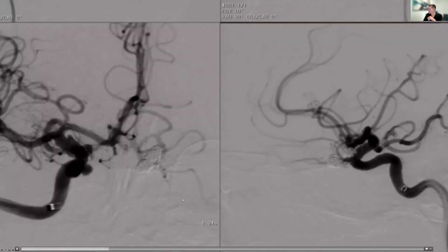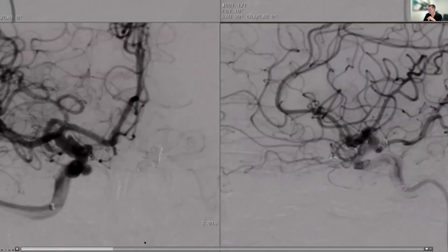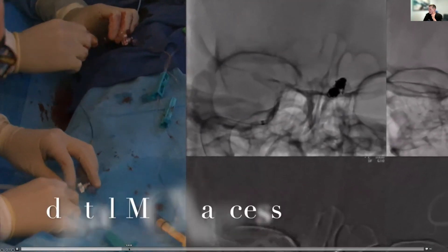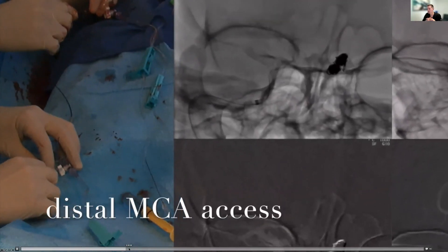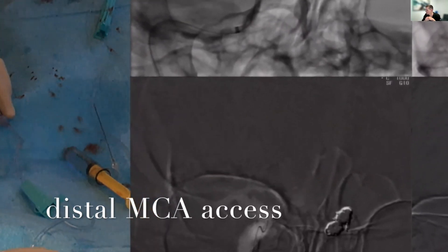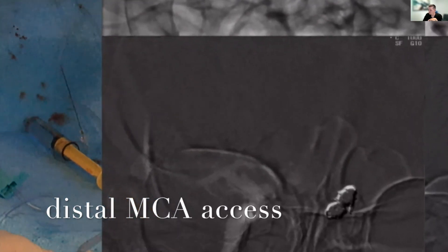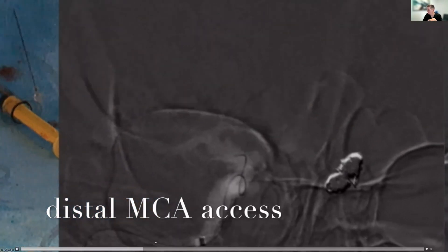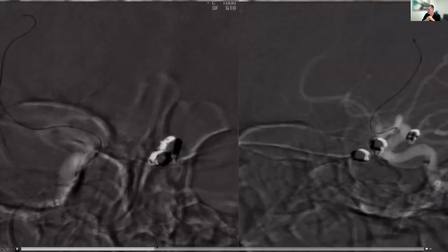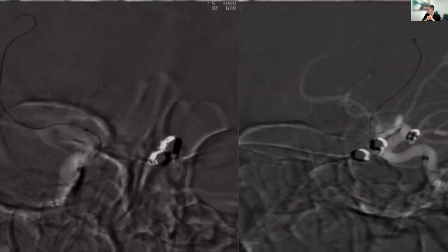This is a pretty simple procedure for most people, and the better the devices get, the easier this becomes. The nice thing about this is you don't have to actually access the aneurysm, so the hemorrhage risk with this kind of procedure is significantly lower. The real complications come in getting the stent to open — having newer devices really helps because the easier it opens, the quicker the case and the less likely you are to have thrombotic complications.